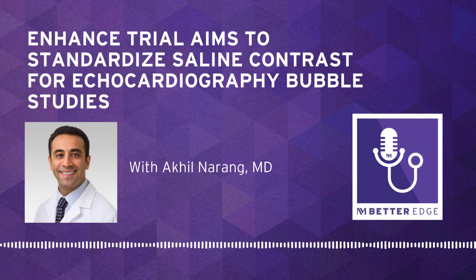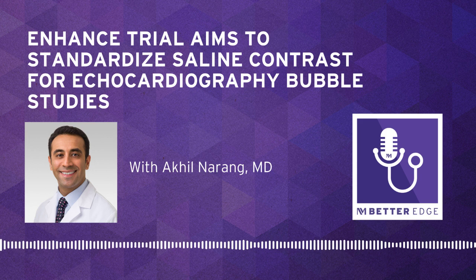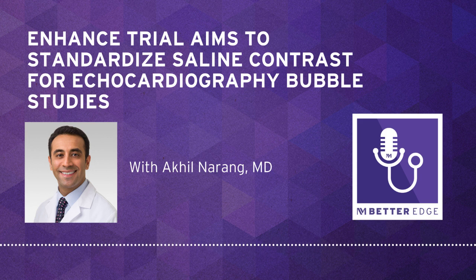So the ENHANCE study attempts to address this with this ready-to-use standardized contrast tool that produces more uniform microbubbles, resulting in clearer, more reproducible imaging.